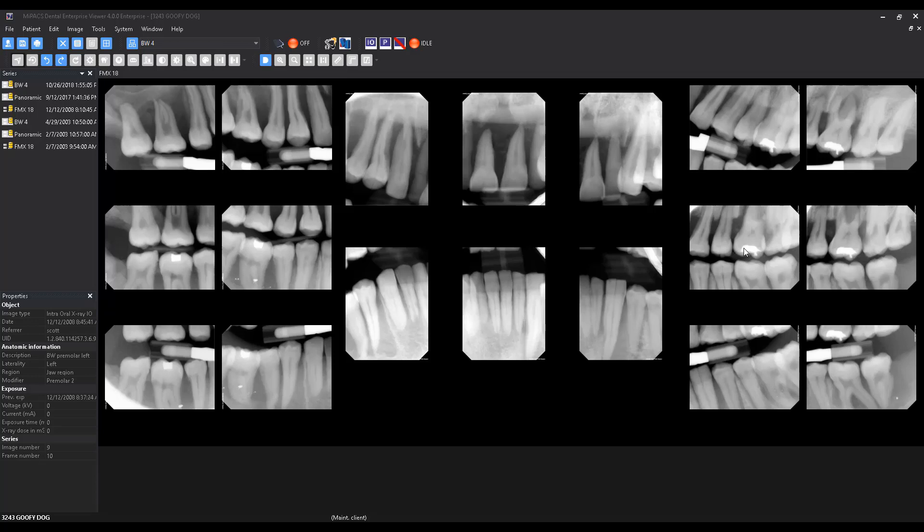By covering up the lighter object, such as a restoration, with a black square, one can reduce this effect and see the actual shade of gray present within the image pixel data without the brain trying to enhance the differentiation.